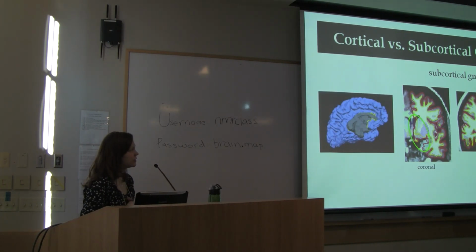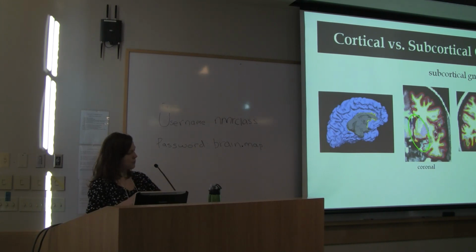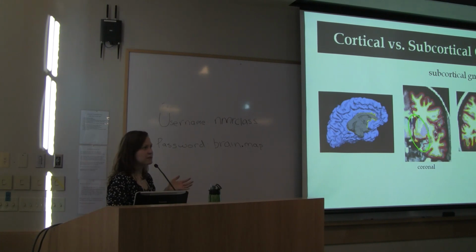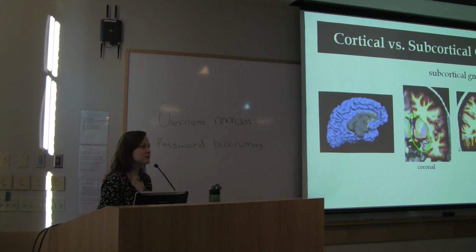What's important to note here is you might see that red surface going through the amygdala. Here's my laser pointer. So you might say, oh, what's wrong with FreeSurfer? The surfaces are not even on the outside of the structures. The surface is really the cortical surface. We use surfaces to measure that cortical ribbon, not to measure the subcortical structures. The subcortical structures are measured by these color maps. So if you see the surface going through the amygdala, that's fine. In the end, we don't take any of the subcortical structures for our total measurement of surface.